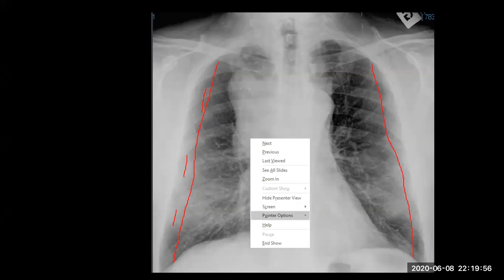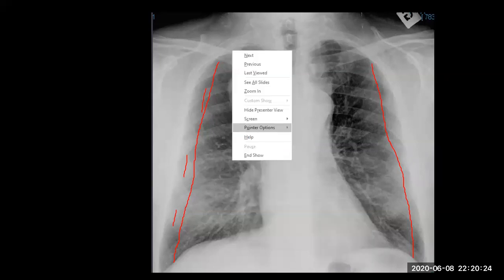Excuse me, doctor. What about thymic hyperplasia? Is it a mass? Yeah, it is a mass lesion. It can be a mass lesion. It can be after radiotherapy or chemotherapy, thymic hyperplasia can look like a mass lesion. And the diagnosis of that mass lesion, what do you do? Classic for thymic hyperplasia.